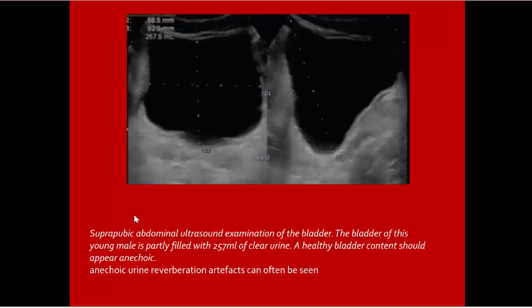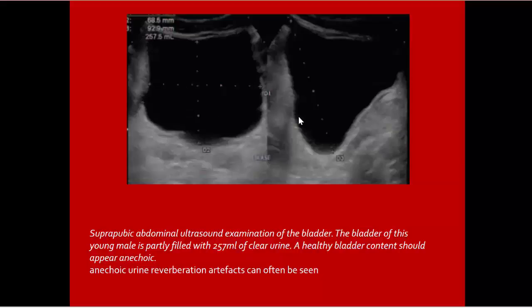Normal urinary bladder ultrasound. Suprapubic abdominal ultrasound of the bladder demonstrates the urinary bladder partly filled with clear urine. Urine normally must be clear with no abnormal echoes. Healthy bladder content should appear anechoic. Urine anechoic; reverberation artifact can be seen.